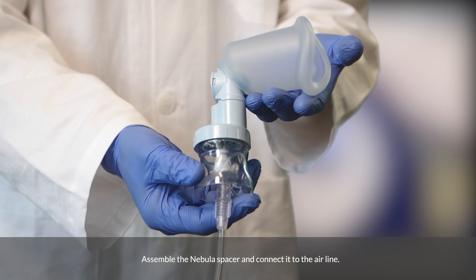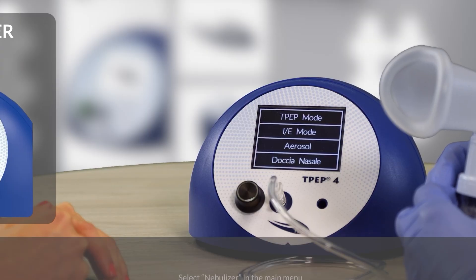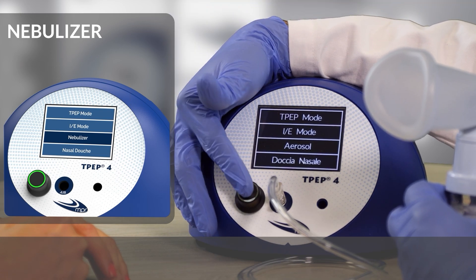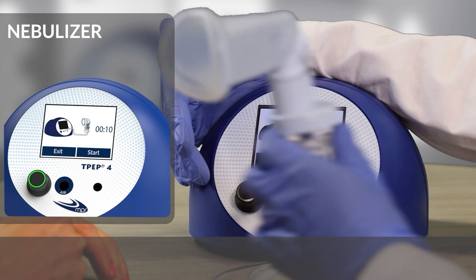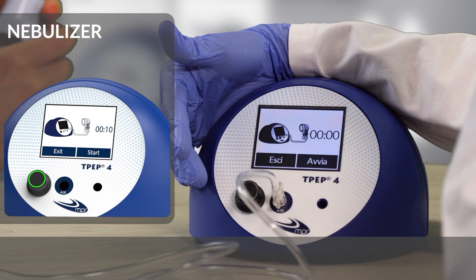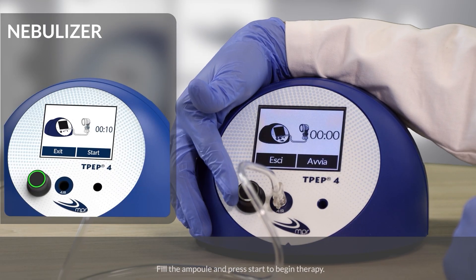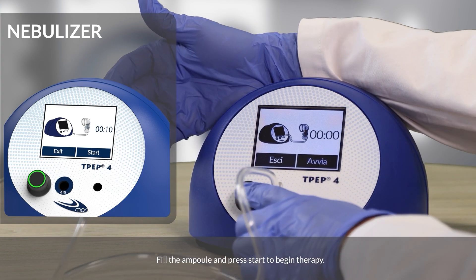Nebulizer. Assemble the Nebula spacer and connect it to the airline. Select Nebulizer in the main menu. Combined with TPEP and Inspiratory-Expiratory mode treatments, the Nebulizer allows a controlled pharmacological treatment of the lower airways. MMAD: 1.9 microns. Fill the ampoule and press Start to begin therapy.